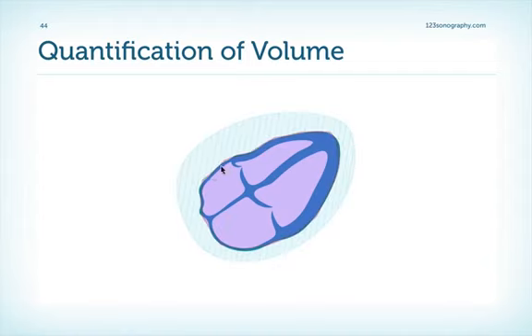Next, you trace the contour of the heart and again calculate the entire volume. And you subtract these two volumes from each other, and you're left over with the actual pericardial fluid. This formula actually works quite well, however there are some discrepancies. Nevertheless, I do find it quite helpful in special situations.